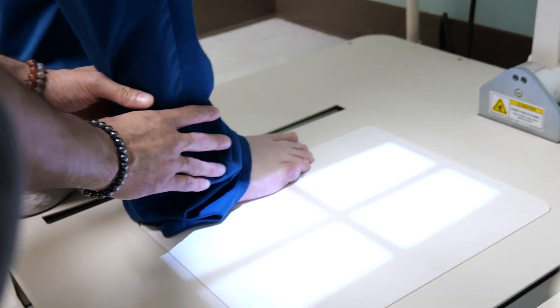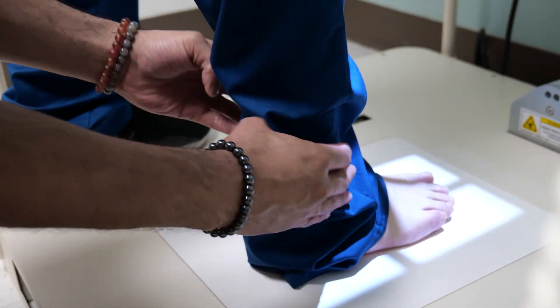By being able to obtain x-rays of the foot and the ankle that are weight-bearing, not only can we look at the bones themselves, but we can look at how they are interacting with each other and how the foot is aligned.